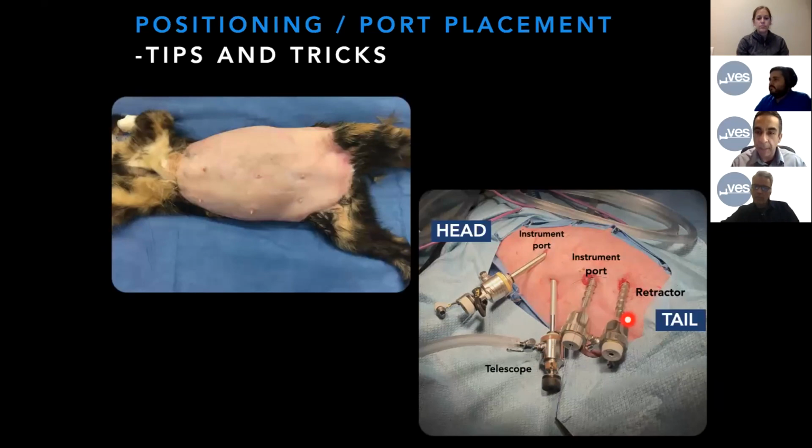In this image, there's a 5 millimeter, 6 millimeter port in there, but certainly the mini lap with a 3 millimeter port, that's something I use frequently as well, the needlescopic. We recently got the 2 millimeter instruments in. I think that's a great addition.